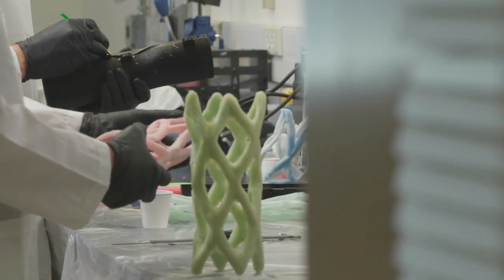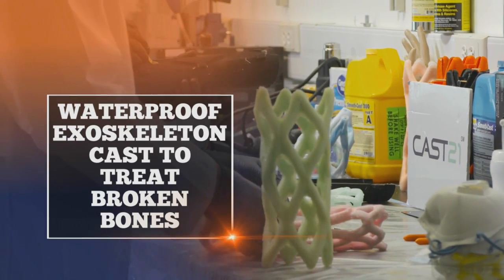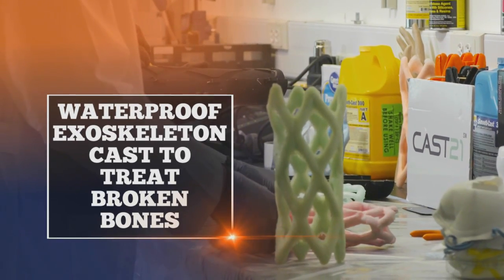Cast 21 started as a design project and we have developed a waterproof exoskeleton cast to treat broken bones in a more hygienic and patient-friendly manner.